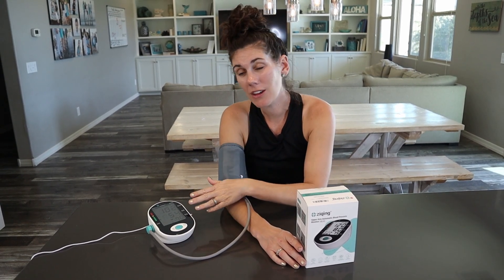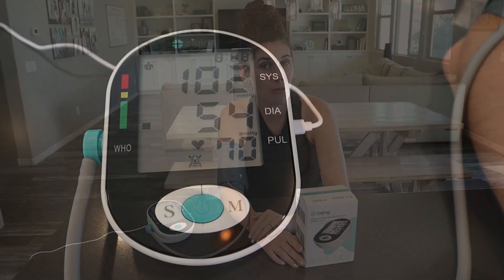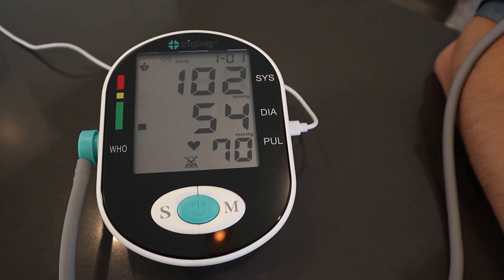You only need to press the power button — you don't need to worry about any of the other things. So if you're looking for a really simple way to check your blood pressure and your pulse at home, go ahead and pick one of these up today.